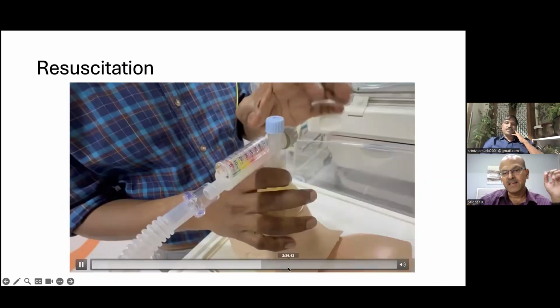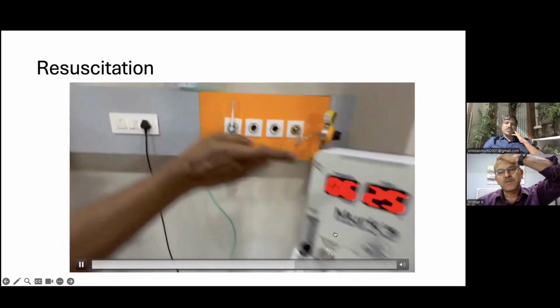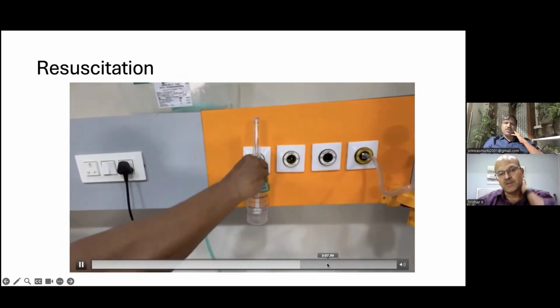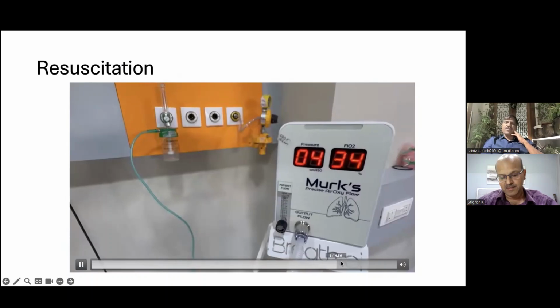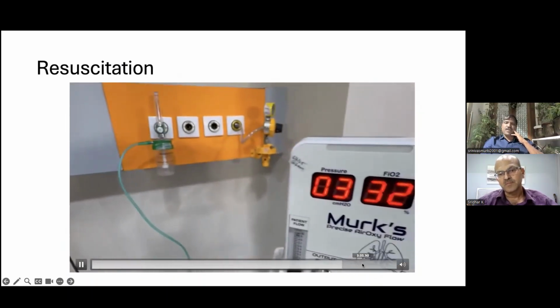Can this be sterilized and reused, or is it single use? No, the circuit is disposable. But you can make a circuit which is reusable, but the leaky valves are difficult. It fits in with everything. This is a standard oxygen input from the TPs.